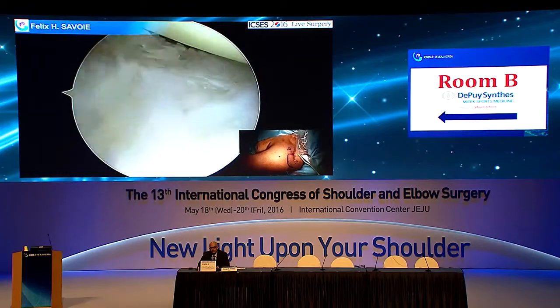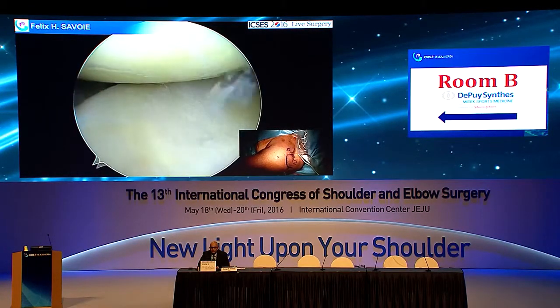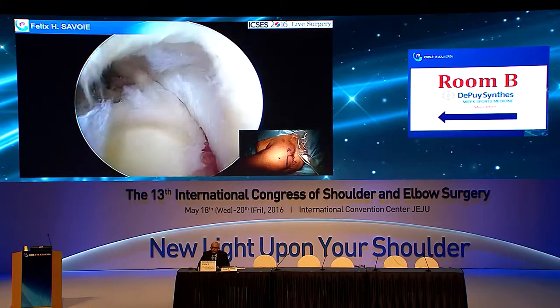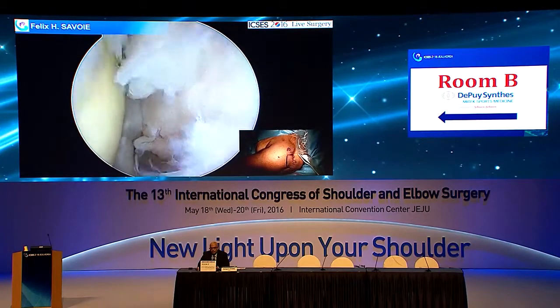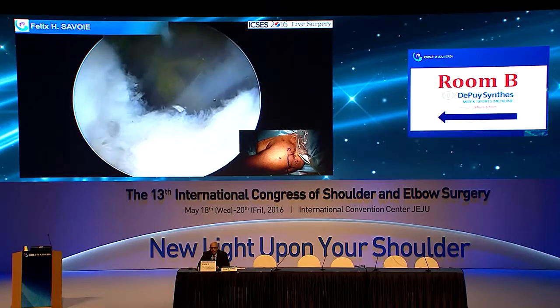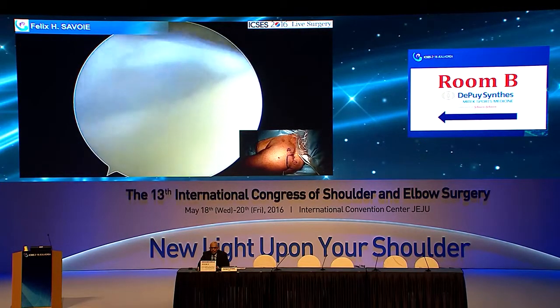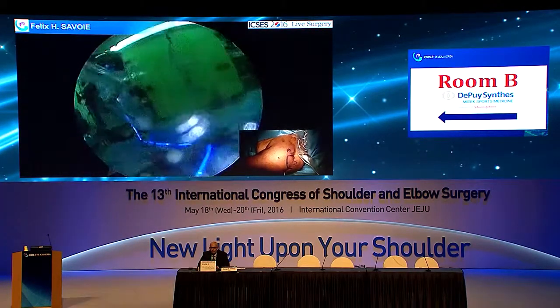We can lift up, so there's no inferior capsular contracture, and indeed, you can see the head sitting down, so we don't need to do any kind of an inferior release. We come back up at the superior labrum, rotate up, and find our cuff, and there's our tear, and we can actually drive up and all the way through. So small, full-thickness tear in the rotator cuff. So that pretty much completes the diagnostic scope, so we don't have to do anything. We'll move up to the bursa now.